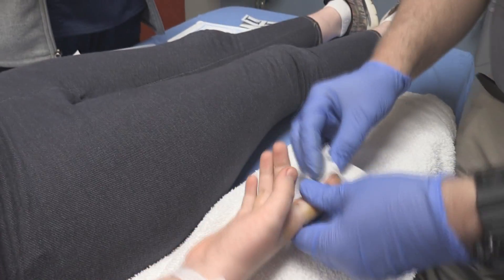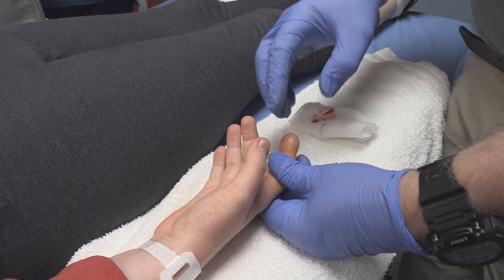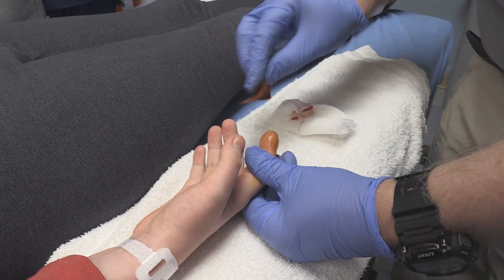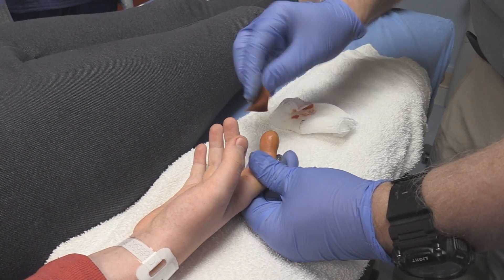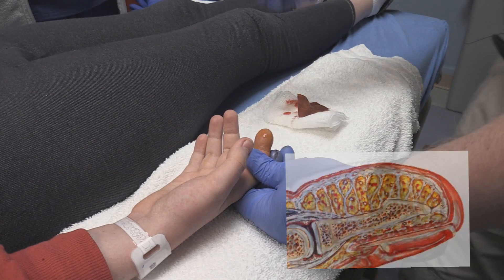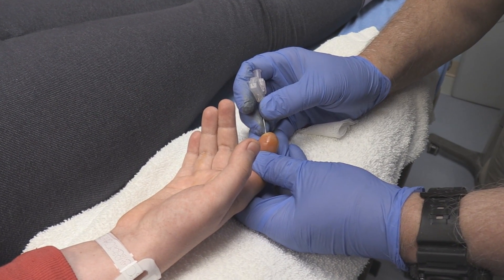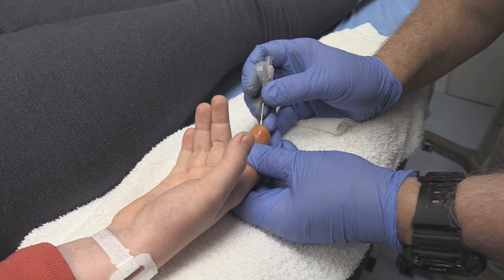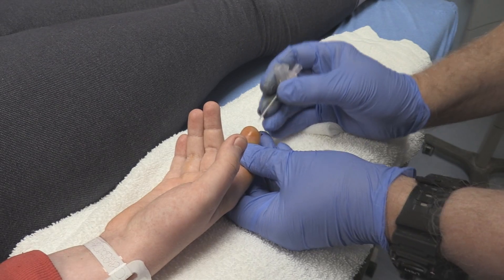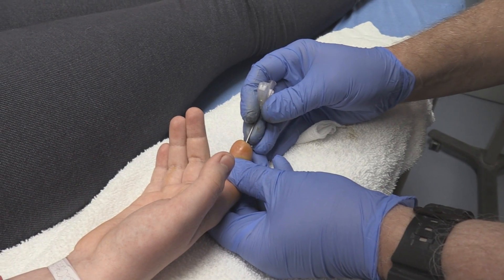Turn your hand over like this. Give me another betadine swab. There are multiple little compartments. Felons, in my opinion, are compartment syndromes. The problem with these fingers is that there are like maybe 10 to 15 little compartments. So with my experience doing compartment decompressions, I use an 18-gauge needle and I'm just going to go ahead and poke here. It's going to bleed a little bit. I'm going to poke at least three or four times, and what this does is it actually decompresses this. Watch and see what happens with the swelling. She shouldn't be feeling a thing here.